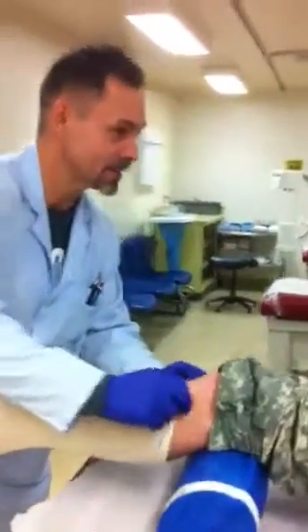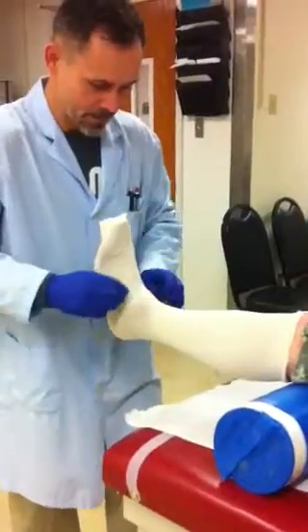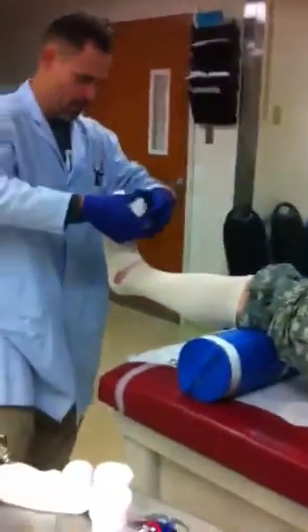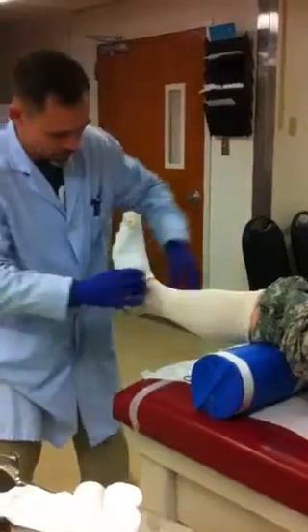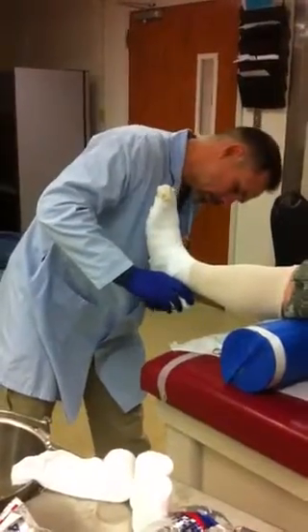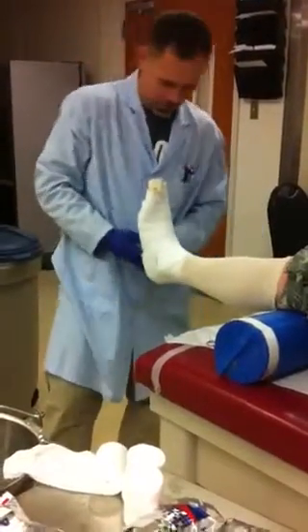So what I'm doing, other than pulling Paul's hair, is I'm applying the stockinette. It's kind of a sock — the very first layer of a cast. And I'm cutting away anything that can cause wrinkles. Wrinkles are bad under a cast because they can cause pressure sores, and if the patient is diabetic or has skin issues, those pressure sores can cause further damage like gangrene, or infections if the cast gets wet.